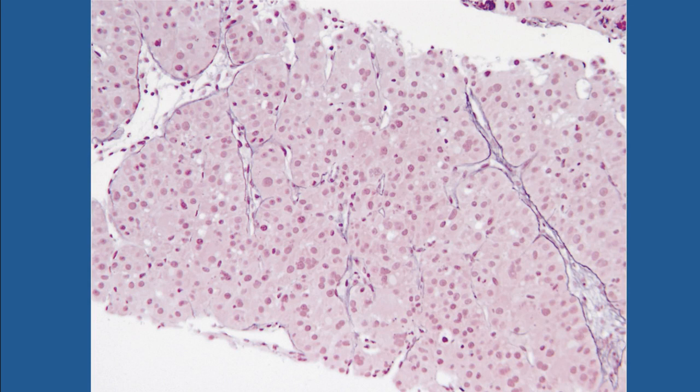And finally, the reticulin stain is extremely, extremely useful for the diagnosis of hepatocellular carcinoma. It is the best stain, in fact, for the diagnosis of hepatocellular carcinoma. And what we see here are thickened plates. But I think it is more appropriate to call this pattern a reticulin poor pattern. So if we have a tumor and we are wondering if this is a hepatocellular carcinoma or not, you do a reticulin stain. If you see a reticulin poor pattern, you can be quite confident that this is a hepatocellular carcinoma. We use it diagnostically all the time.